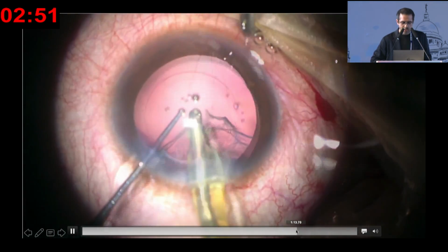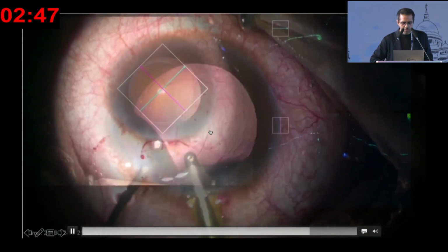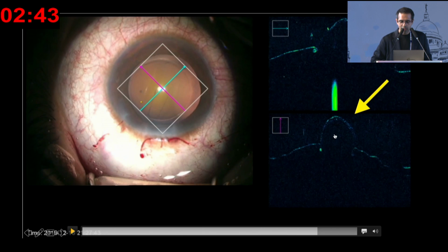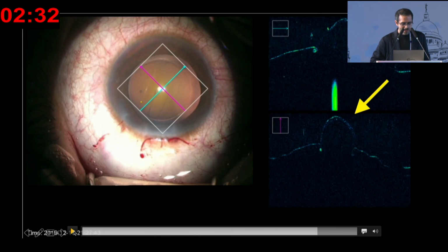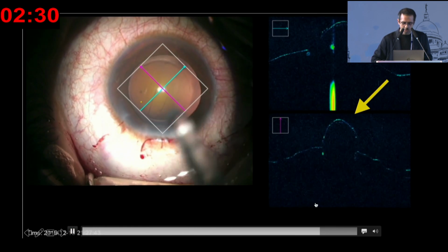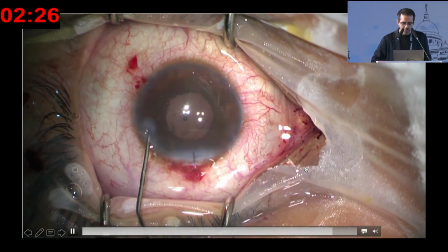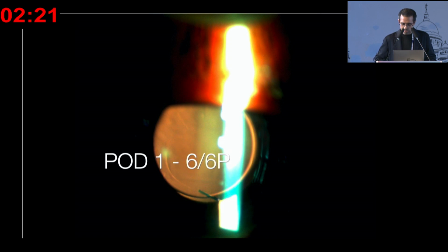Yes, of course, there is a pole-to-pole discontinuity as we had expected. If you see this very interesting image, you can see that there is a discontinuity in the posterior capsule, but a vitreous blob is coming inside the capsular bag, though it is not discontinuous. That means the vitreous has not been damaged till now. The anterior hyaloid face is not damaged. So we put a lens in the sulcus and close the eye. This patient also did very well, and we gained 6/6 vision on the first day itself.